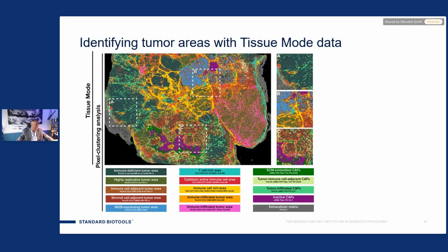And what it does is it scans the entirety of that tissue. Well, the first thing it does is you define your markers. You say, in my panel, what are the markers that I want to analyze? And you define the markers, all 41 in this case, or maybe 35, whatever you decide to do, any number or combination, and you simply ask it to cluster those. And it automatically clusters into 8 clusters, 12 clusters, 16 clusters, and 20 clusters. And it generates a heat map for each.